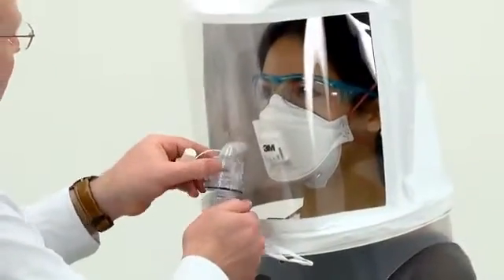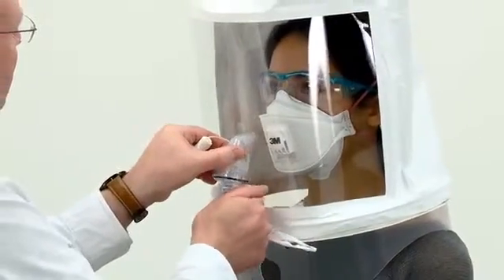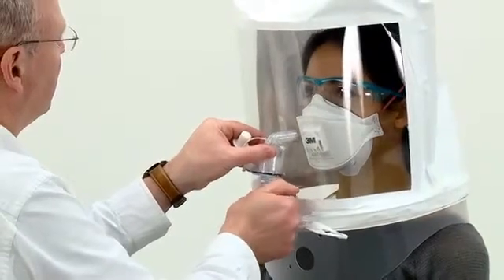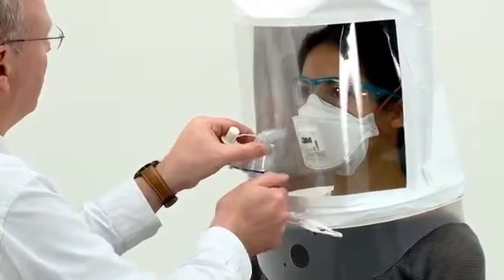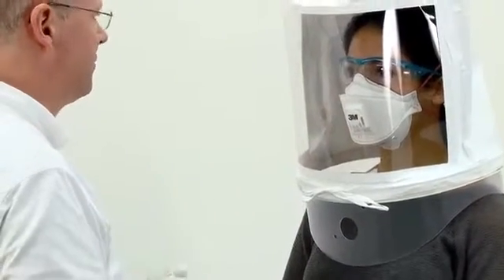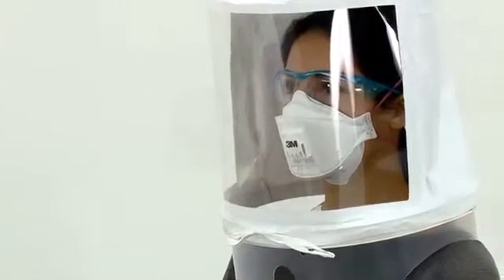Using the fit test nebuliser, inject the fit test solution into the hood. Use the number of squeezes defined by the sensitivity test, i.e. 10, 20 or 30. The nebuliser must be held in an upright position to ensure correct mist generation. For the first of the 7 exercises, ask the subject to breathe normally and start a stopwatch or note the time on the second hand of your watch.